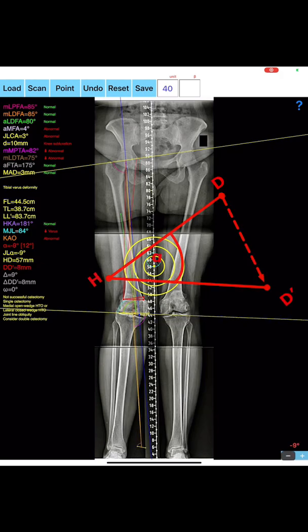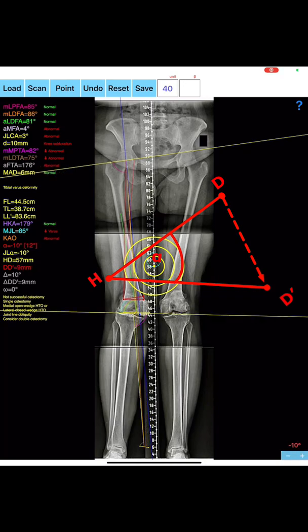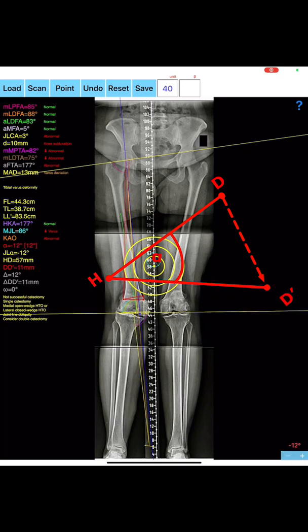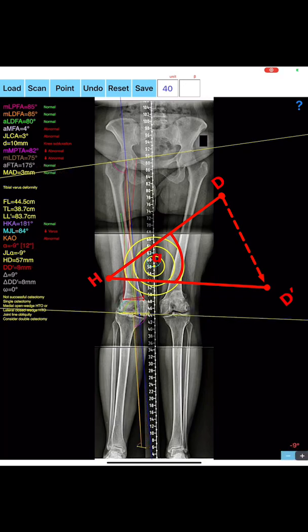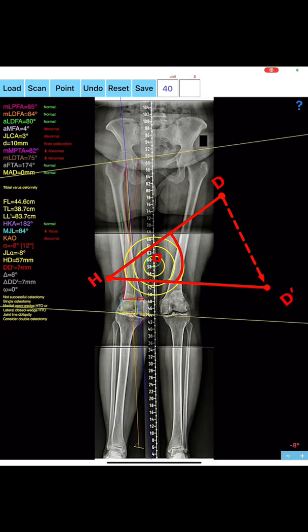The planes of the osteotomy HD and HD form the angle which is the actual correction angle of the wedge. The base of the triangle DB at the lateral cortex corresponds to the height of the wedge. By pressing the plus or minus button, with center at the hinge point either clockwise or counterclockwise, the corresponding height DD of the opening or closing osteotomy is increased or reduced respectively.